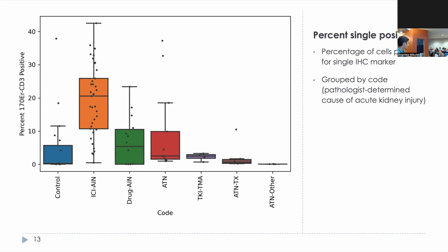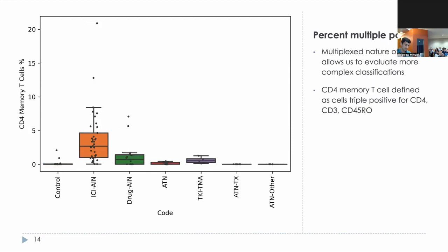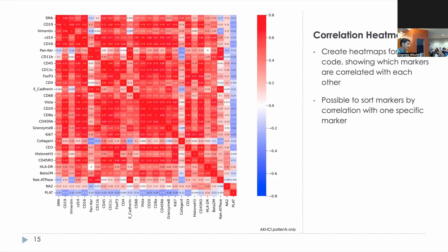Many immune cell types are typically defined as positive by more than one marker. As each cell in our dataset contains a list of markers it's positive for from our multiplexed panel, we can query cell types in an a priori manner. Here we measure the percentage of CD4 memory T cells, defined as those that are triple positive for CD3, CD4, and CD45RO. As we have 27 markers present in our dataset, we can perform a high-throughput analysis measuring the correlation of marker densities to one another. This heatmap can identify redundant and autocorrelated markers, helping refine an IMC panel to capture greater heterogeneity.